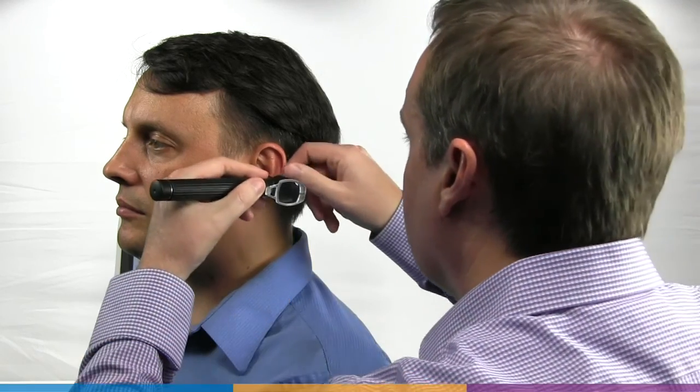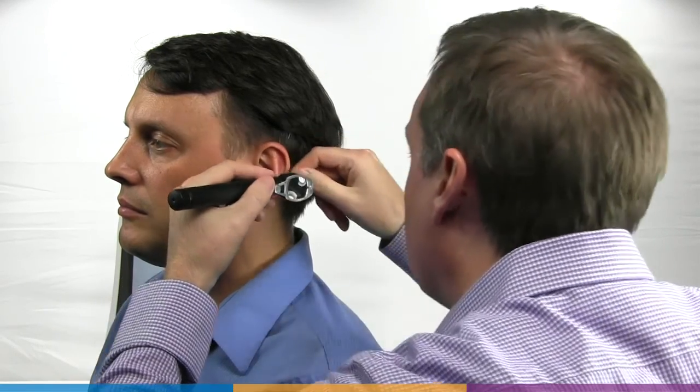First, use an otoscope to ensure there is no ear canal obstruction, for example cerumen, and to get a sense of the ear canal length.